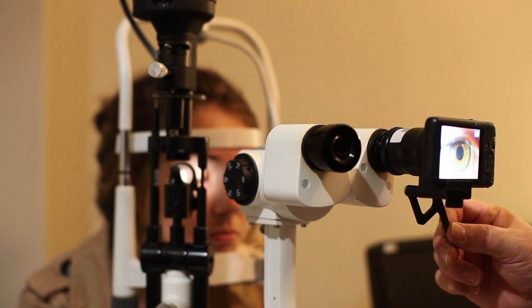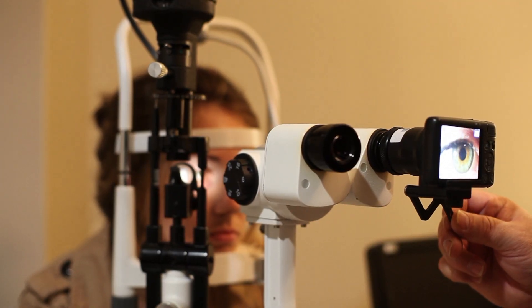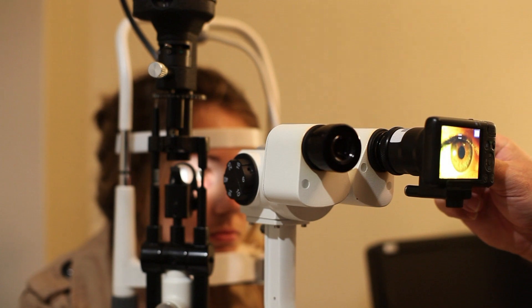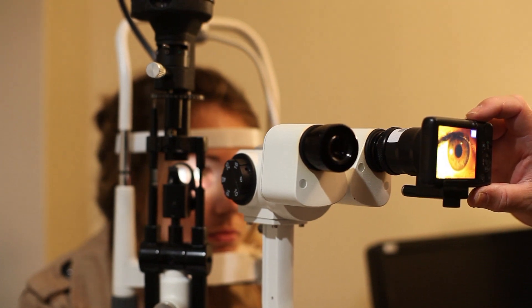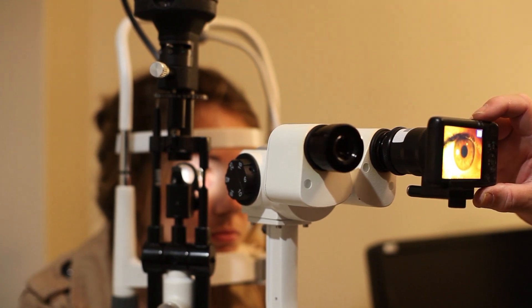Note, the slit lamp eyepiece adapter comes in two models, standard or with a yellow filter.